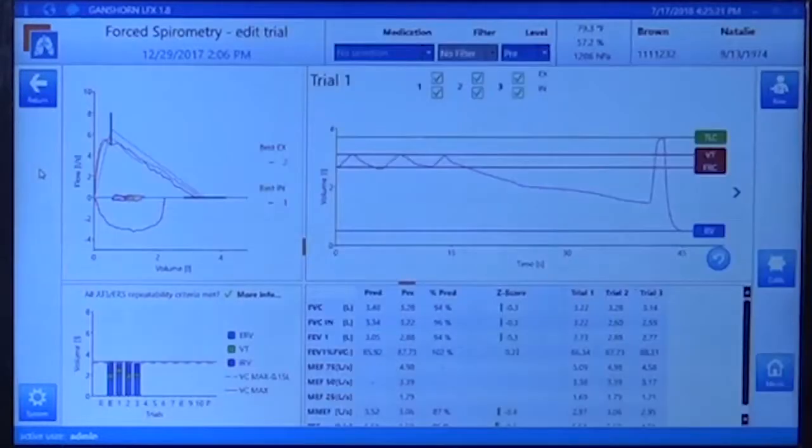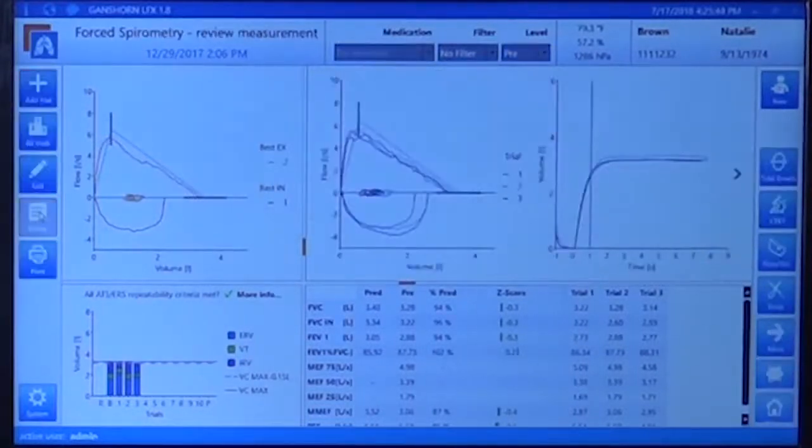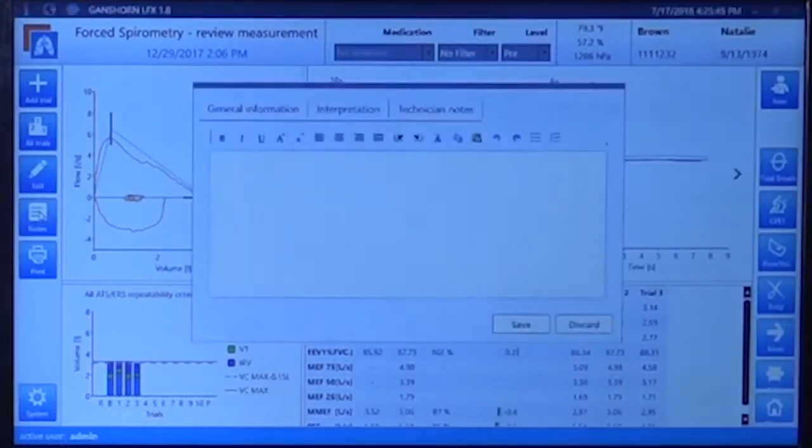And if I click on notes, I can enter in a Word-like format the technician notes on the test, the general information of the patient needed, and also we will have the automated interpretation of this test. In this case, it says it is a normal test, the spirometry results are within normal limits. If I agree with it, I will just save, or I can discard it and put my own interpretation.